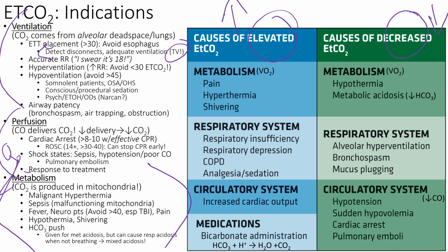Okay. Do the GEs accept the side stream? Mm-hmm. Okay. Yeah, you just attach it, it splits. One goes to the wall for your O2 flow meter, and then one goes to your adapter right there, to your little water trap.